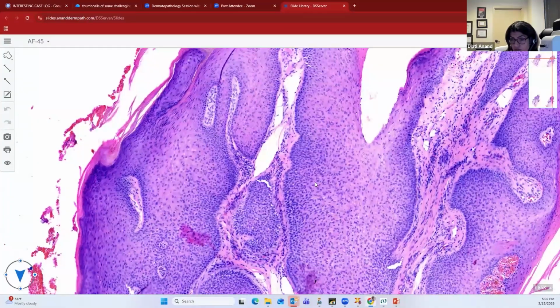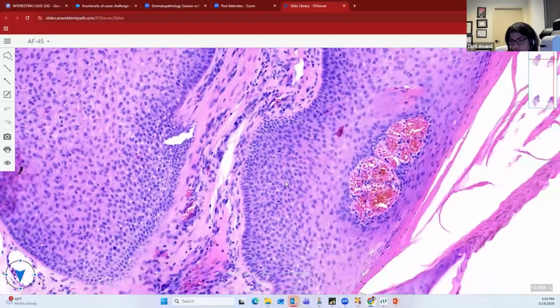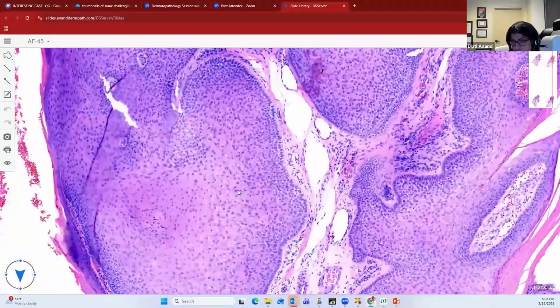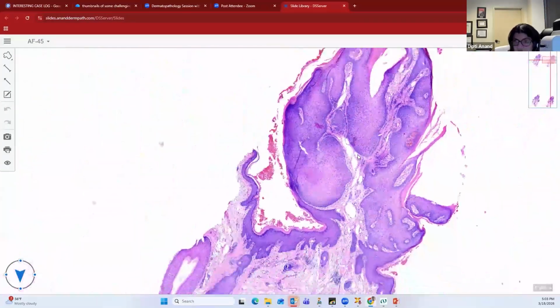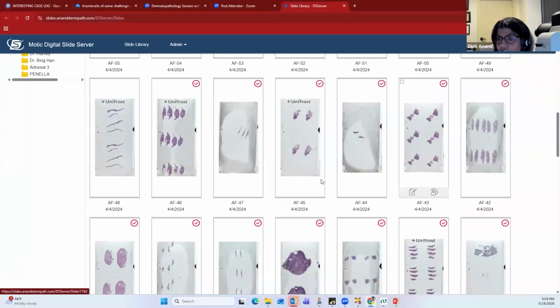They have these large bluer cells, which are going to be your basaloid cells. And then you have these nice cells, which will have the distinct cytoplasmic borders and the pale eosinophilic cytoplasm. So it's just another terminology. This is called a trichilemmal verruca, but these are also completely benign. So let me show you another example of trichilemmal verruca.